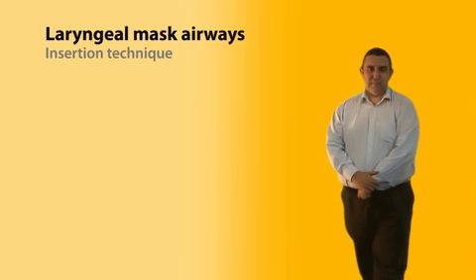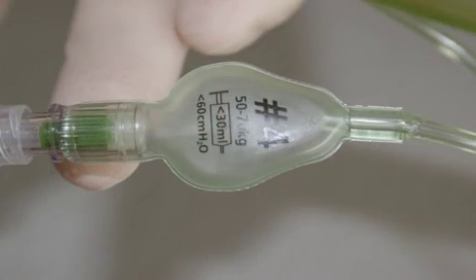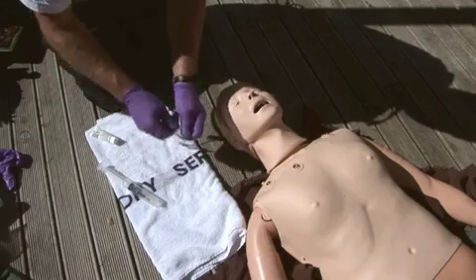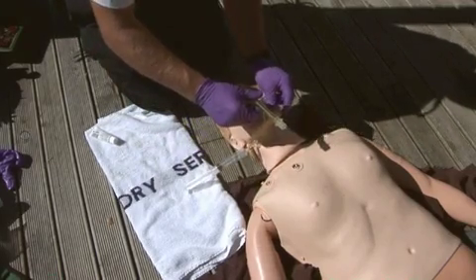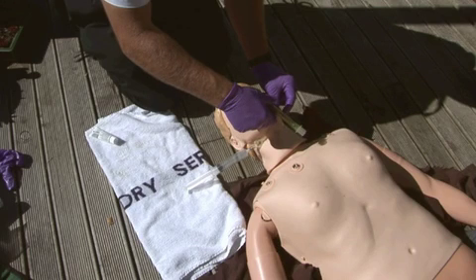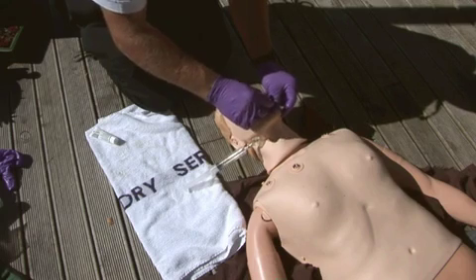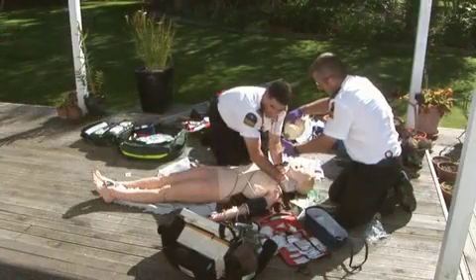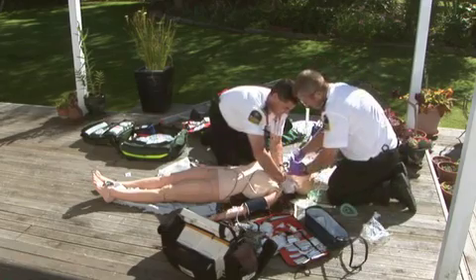For LMA insertion: select the appropriate size for the patient, then select an appropriate size syringe — the attachment will show the volume of air required. Completely deflate the cuff and lubricate the anterior and posterior surfaces of the tip with KY lubricant. Place the head in a neutral position, open the mouth, and grasp the LMA with the opening facing the patient's tongue. Hold the jaw while pushing the LMA backwards around the curve of the tongue, maintaining backwards-downwards pressure until resistance is felt. Inflate the cuff, attach a self-inflating bag, and ventilate, checking for symmetrical chest movement. Once satisfied, secure the tube with a tie, tape, or a Thomas tube holder.